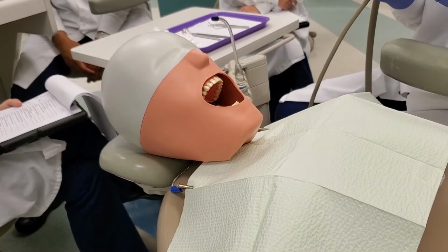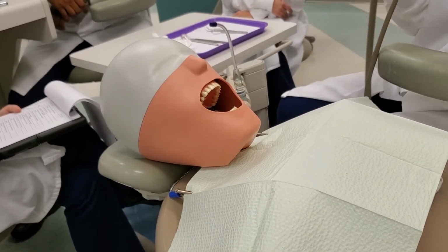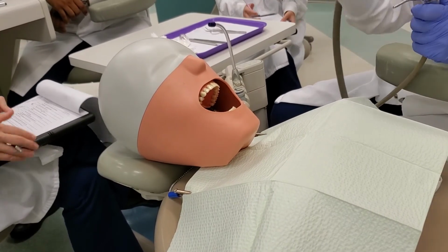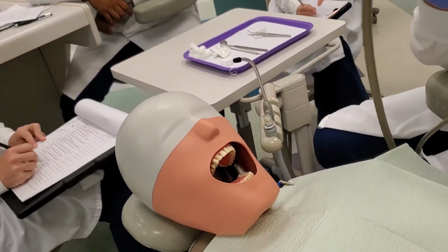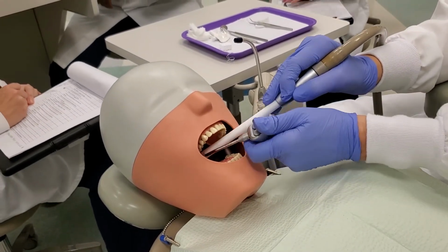Place the HVE tip on the facial side of the left quadrant and posterior mouth. Repeat same steps for mandibular left. What does that mean? Basically, you're getting ready to do a full mouth rinse, okay? And the pattern that they're keeping you at is you're going to start in the upper right, okay? So, again, pen grasp, because you're not retracting. Pen grasp, so you're going to go back, the midline, and back.